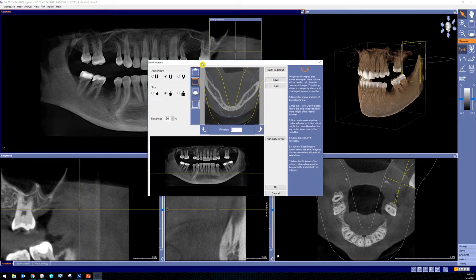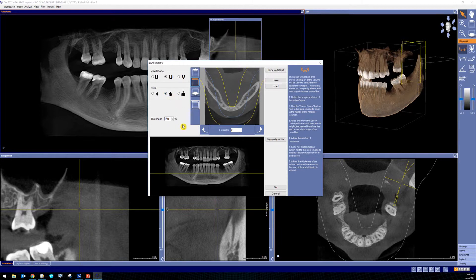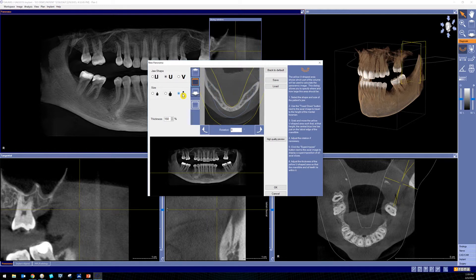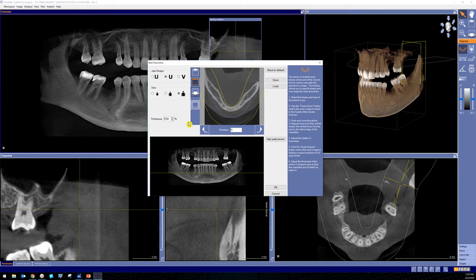A window pops up that says New Panorama, and it's at the default values right now — the U-shape jaw, the average patient size, and the thickness is at 150%. The U-shape we'll use in this particular case, but 90% of the time I'm going to want you to select the larger patient. Thickness will typically range anywhere from 150%, and if you click one up, it actually jumps to 175. Use your best judgment depending on the thickness of the jaw.